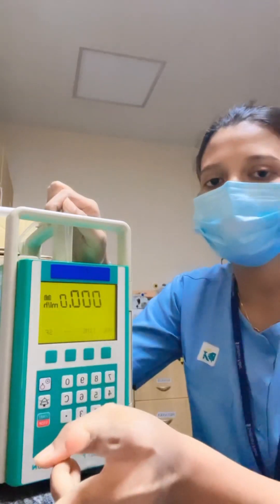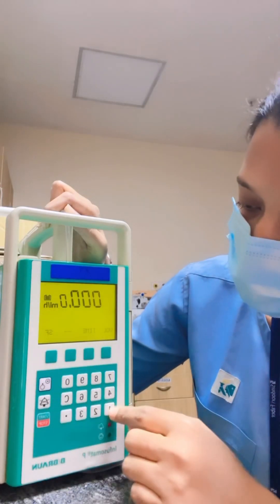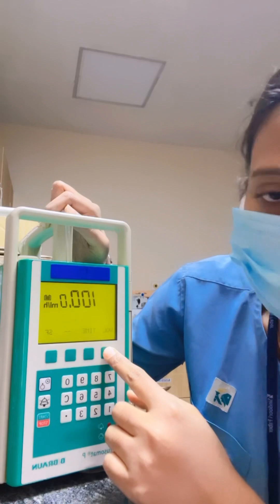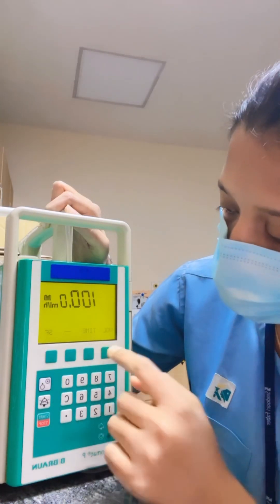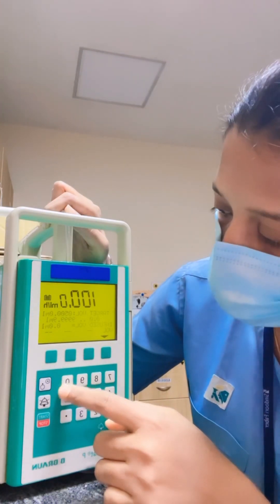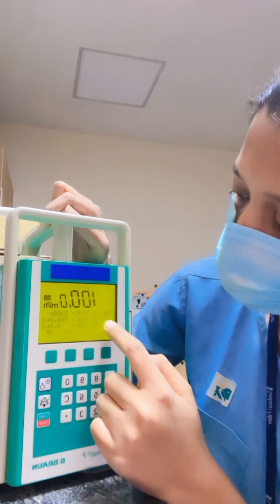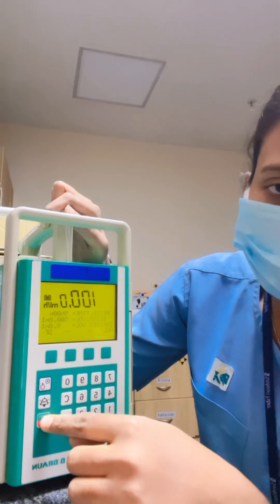I'll be setting the rate to 100 ml per hour. For setting the volume, press the soft key below 'volume.' I'll be setting the volume to 500, as the IV bottles have a 500 ml capacity. After this, press confirm — the residual time is already calculated automatically.